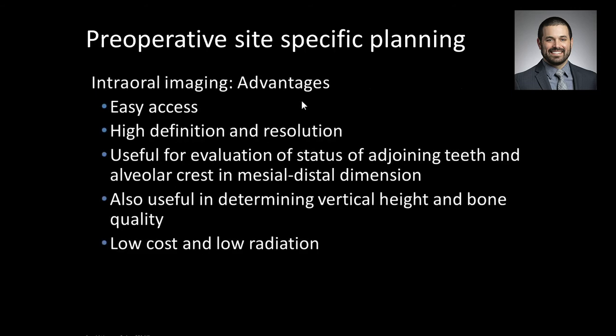So if we look at first intraoral imaging advantages, of course, it's really easy. It's really high resolution, higher resolution than cone beam CT by a wide margin, actually. It can tell you the status of the adjacent teeth and the alveolar crest. It can tell you a little bit about vertical height and bone. It's low cost and low radiation.